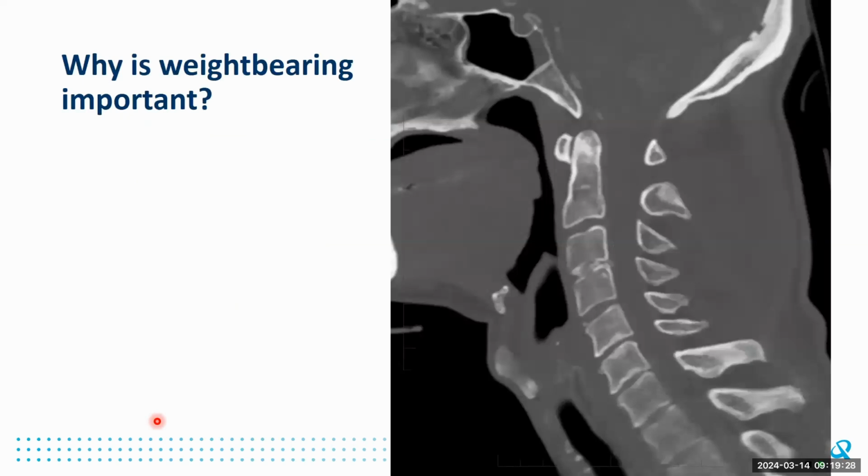So this is a patient who came through one of the Gold Coast practices after a fall in the surf. He's like a 50-something-year-old lawyer who had landed on his head in the surf. He had a CT, a CTA, and an MRI, and the alignment was the same in all of these images. There were no fractures. There were some obvious soft tissue injuries on the MRI, but he went to see Jeff Askin, who we work quite closely with at Bowen Hills, who was concerned that there was some instability that hadn't been picked up on the CT or MRI.